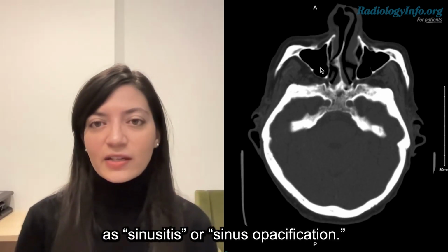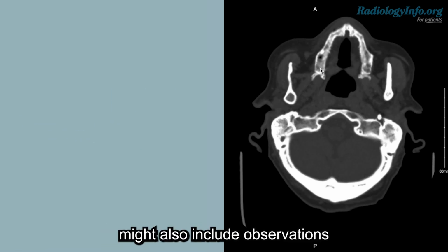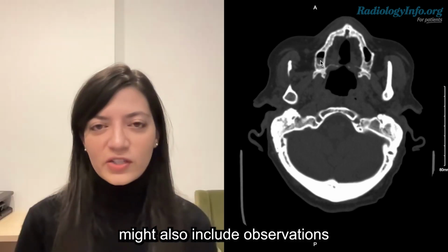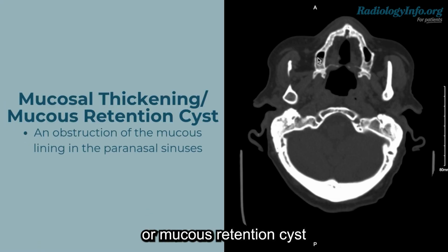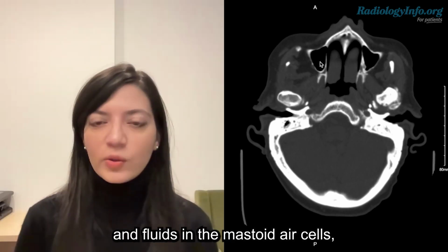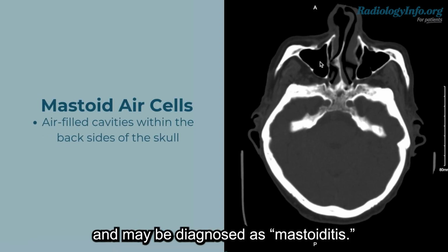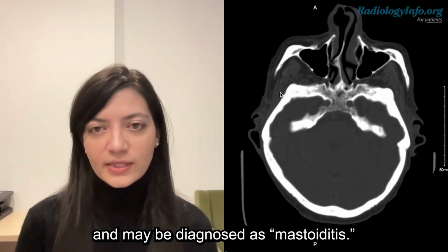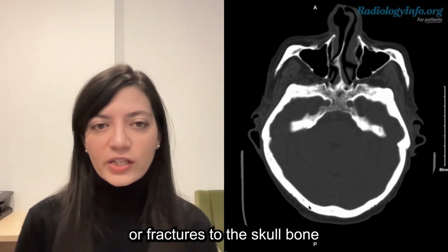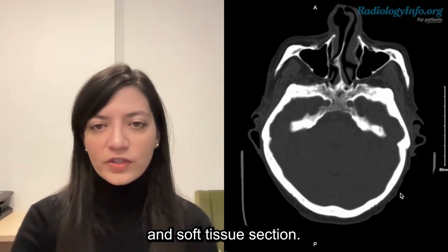in the report as sinusitis or sinus opacification. The report might also include observations about mucosal thickening or mucus retention cyst in the paranasal sinuses and fluids in the mastoid air cells, which can lead to headaches and may be diagnosed as mastoiditis. Any signs of trauma or fracture to the skull bone will be noted in the bones and soft tissue section.